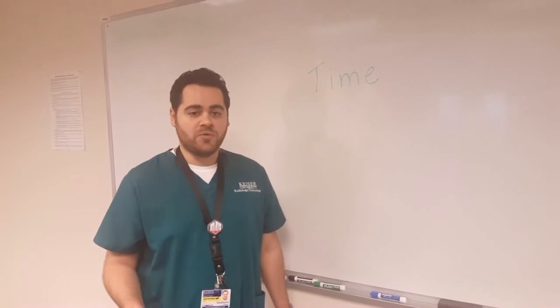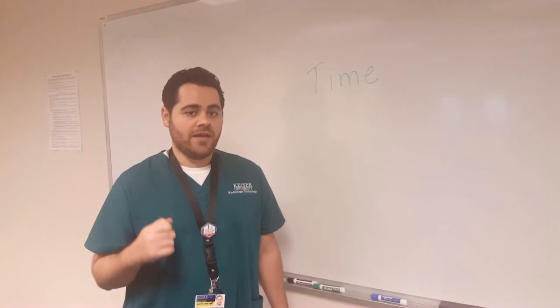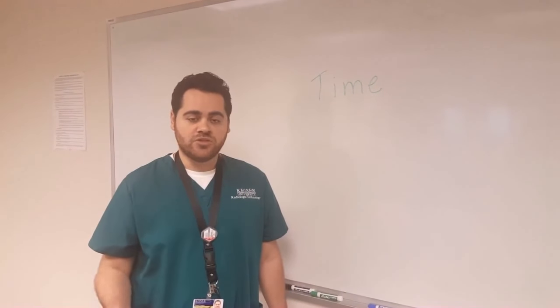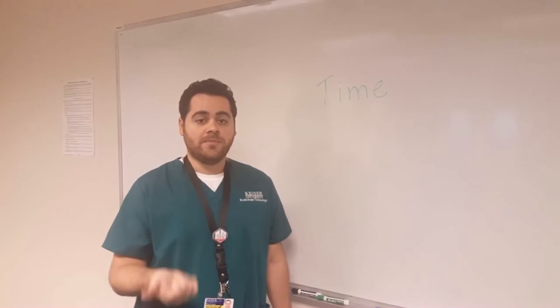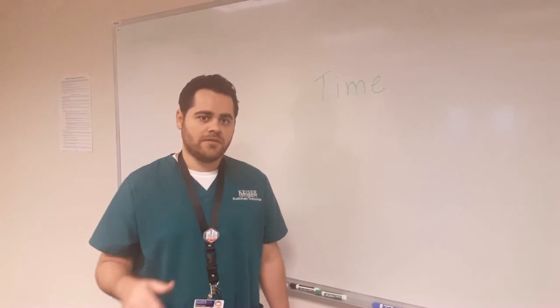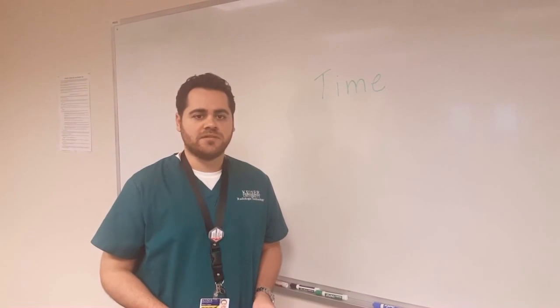Today a few modern machines have a minimum response time of 1 millisecond, so the machine can generate an image in 1 millisecond. This is especially useful in pediatric patients, geriatric patients, or anybody with a condition that they can't stay still. That is the number one reason why you would want to decrease minimum response time.